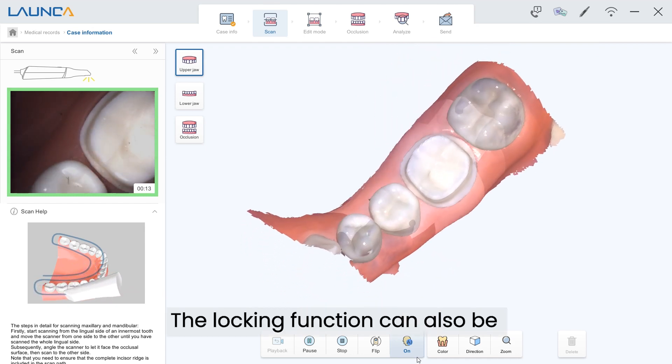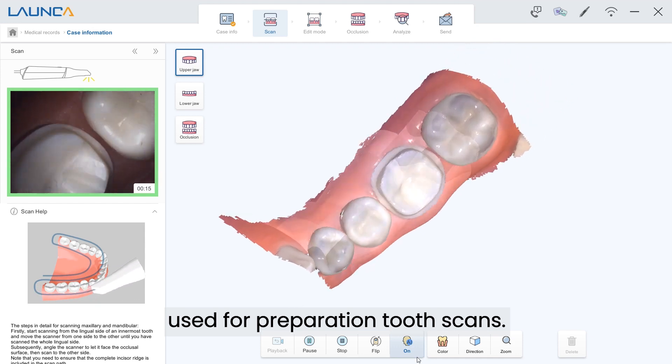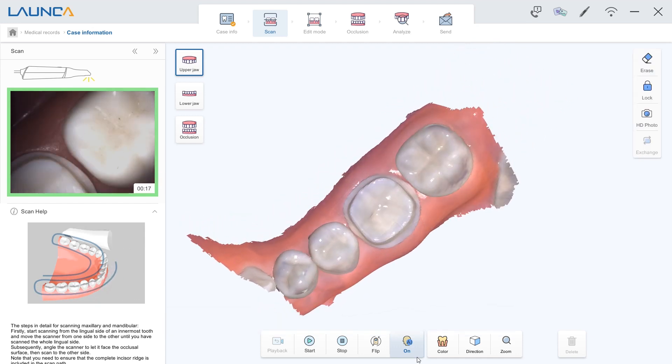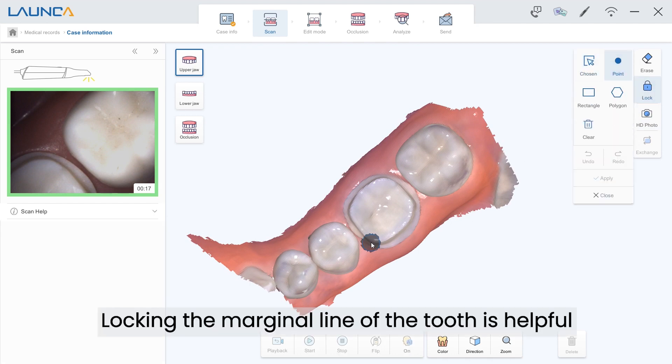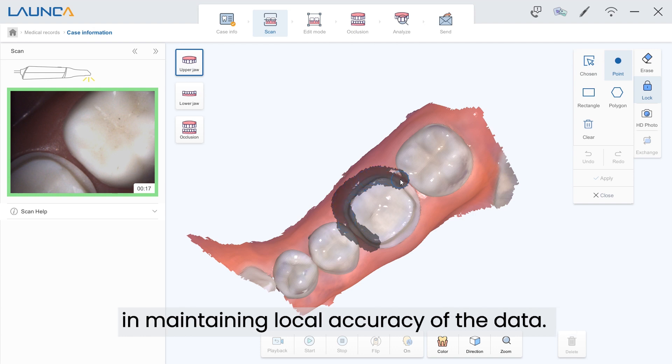The locking function can also be used for preparation tooth scans. Locking the marginal line of the tooth is helpful in maintaining local accuracy of the data.